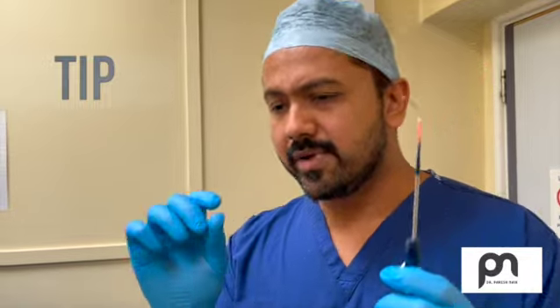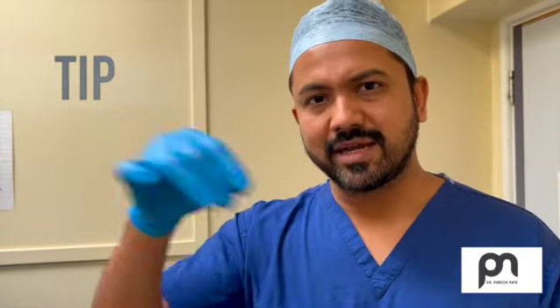So what happens is, you numb the nose. You use whatever local anesthetic spray, lignocaine. I like to make a cocktail of lignocaine with adrenaline. Don't mix it together because it crystallizes, so use it separately. Take a ribbon gauze, dip it in 1 in 10,000 or 1 in 1,000 adrenaline. Dip it in 2% lignocaine. 2% is good. If you want to use 4%, you can use 4%. Put it in the nasal cavity. It will decongest.